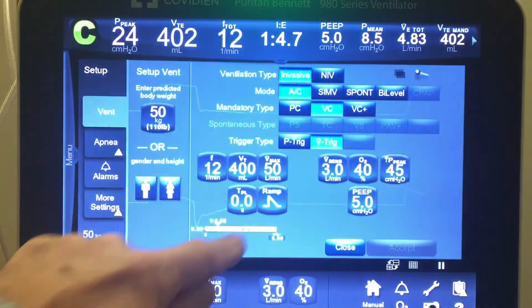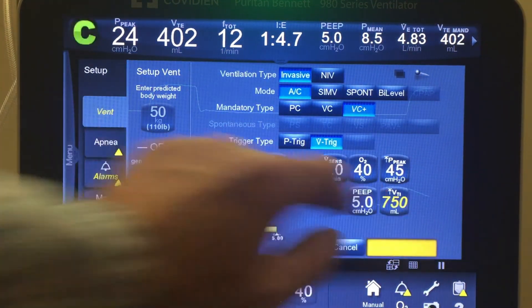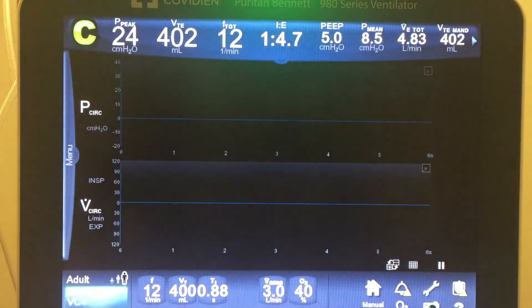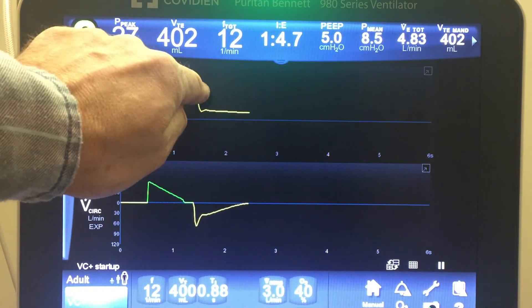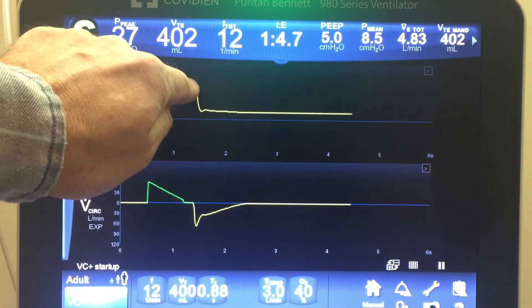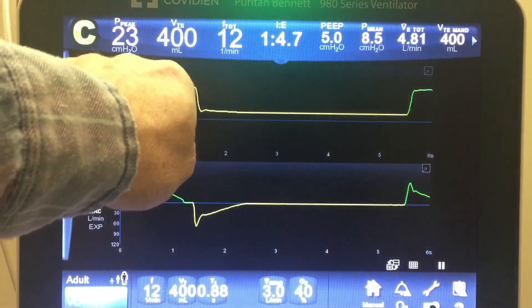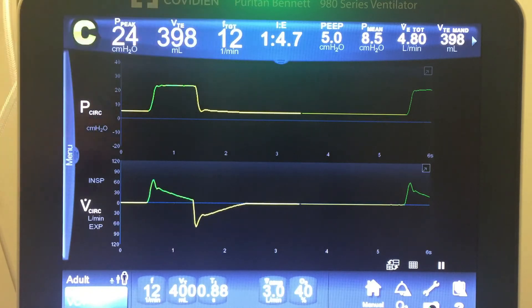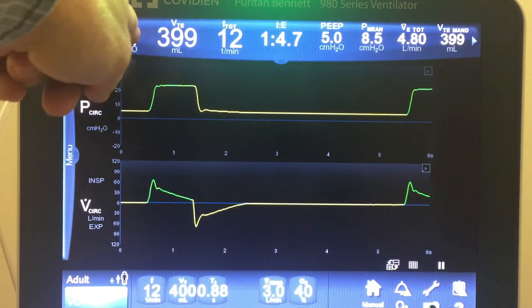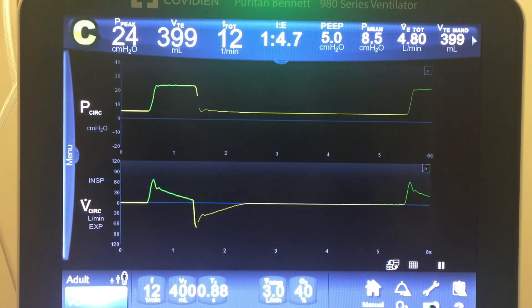Let me hit accept and switch to VC Plus now. Watch for that plateau — I'll point it out. There it is: that little tiny flat portion. It's very quick. On the next breath you'll see it looks different — more flattened. Now it's reading this pressure, and you can see it's the same pressure for roughly the same volume.